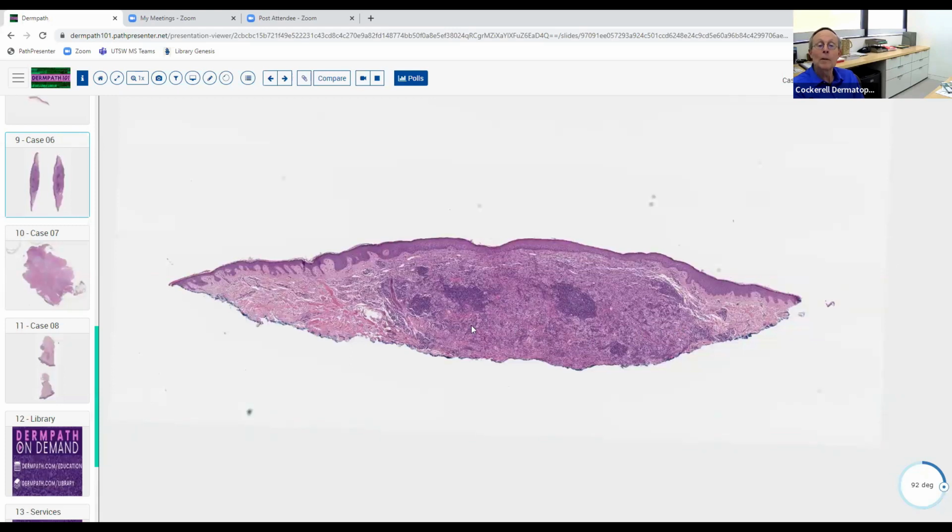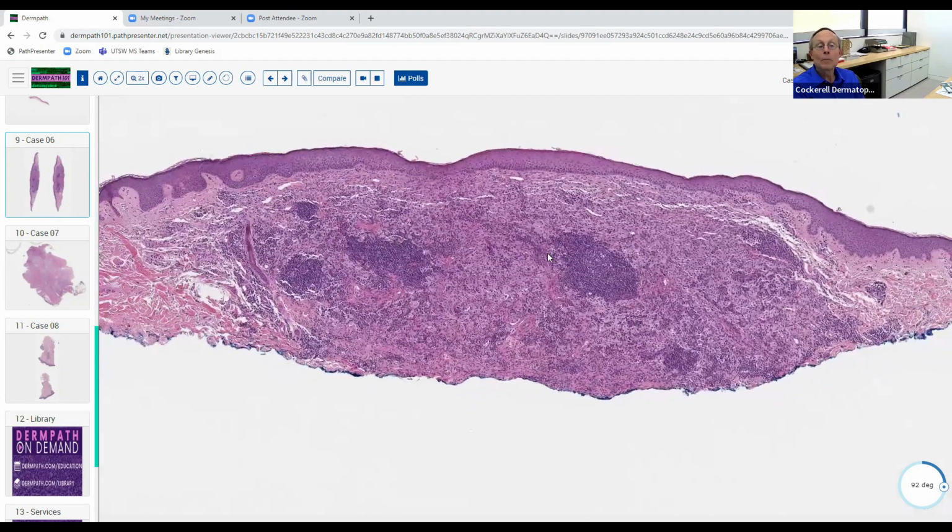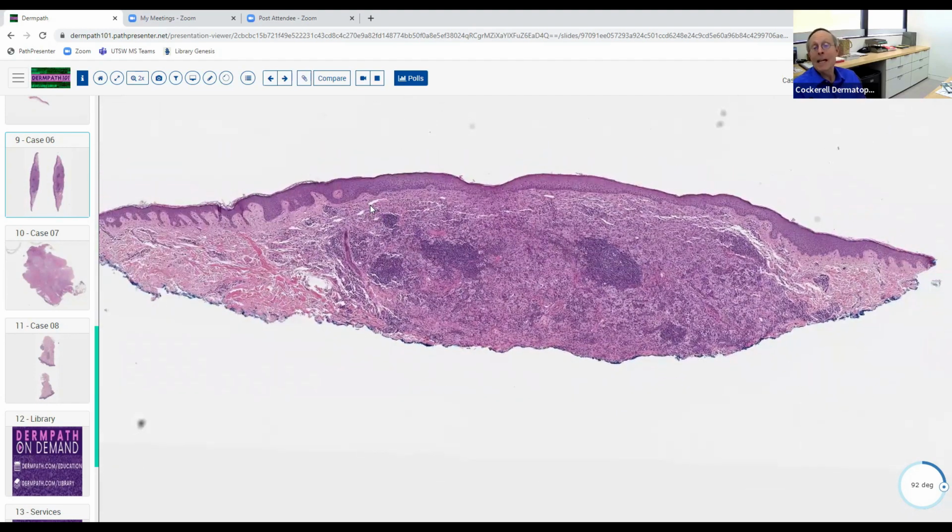But you can also make a good educated, I'm not going to say guess, diagnostic prediction, if you will. For the lighter cells, kind of purple from afar, I would think about histiocytes. Good, excellent. So we've got a nodular aggregation of cells that clearly have a lot more cytoplasm, probably histiocytes, admixed with little nodular aggregates of lymphocytes and maybe some other cells. And it seems to be, if it's a neoplasm, a neoplasm of inflammatory cells. If it's an inflammatory process, what pattern do you think it's mostly exhibiting here?